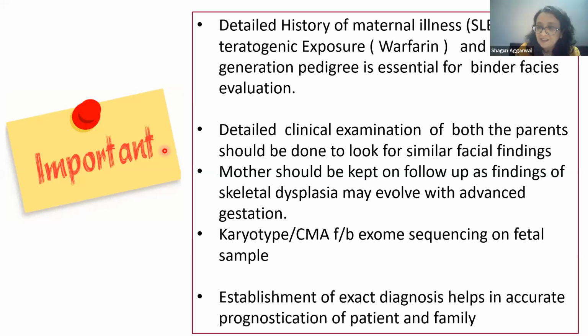Praveen sir, anything you would like to add? I mean, are there any cases where there are very severe antenatal abnormalities suggesting that severe airway involvement is there, where we should counsel the families for some neonatal interventions? No, as you have already stated, it is a phenotype where we have a typical presentation with a flat face. When you take the facial profile, you very clearly delineate an absent or hypoplastic nasal bone, flat facies, nasomaxillary hypoplasia, along with a depressed nasal bone and alar prominence.